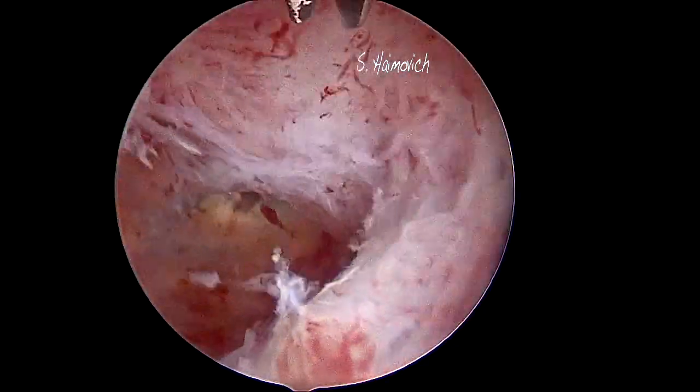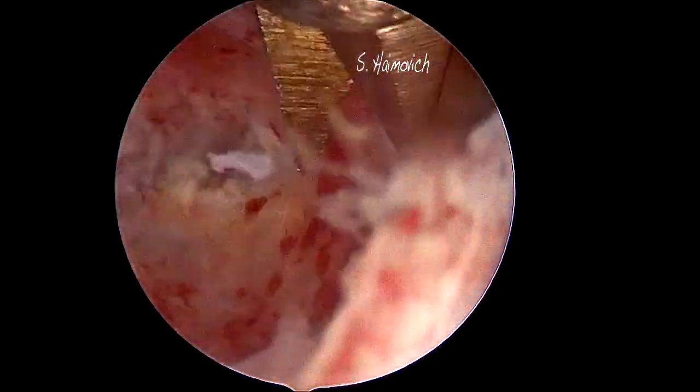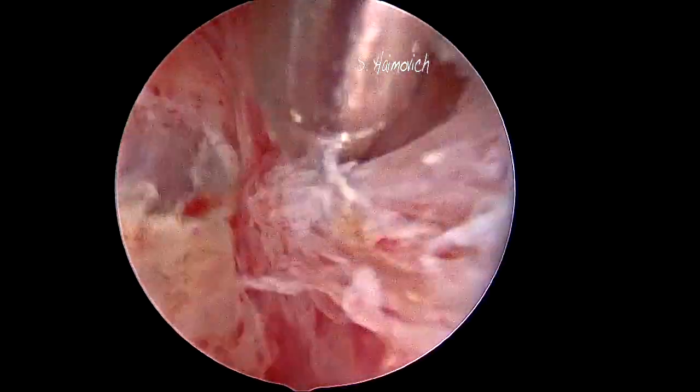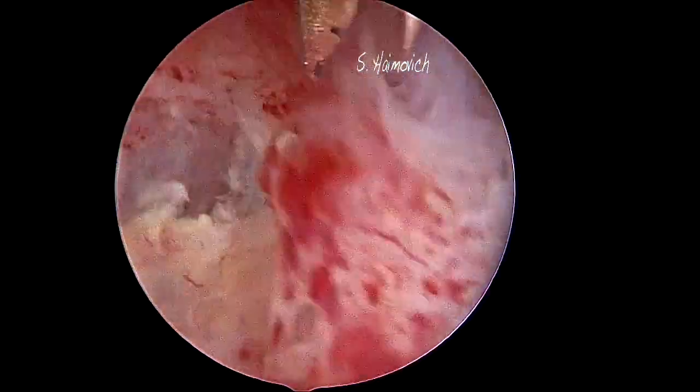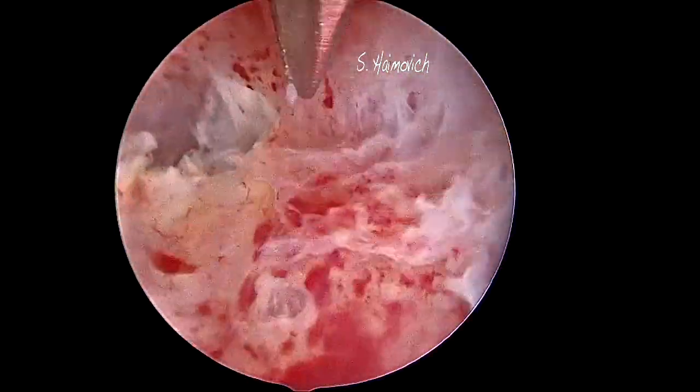With scissors we start cutting the fibrotic tissue. In difficult cases, the use of ultrasound guidance is highly recommended.